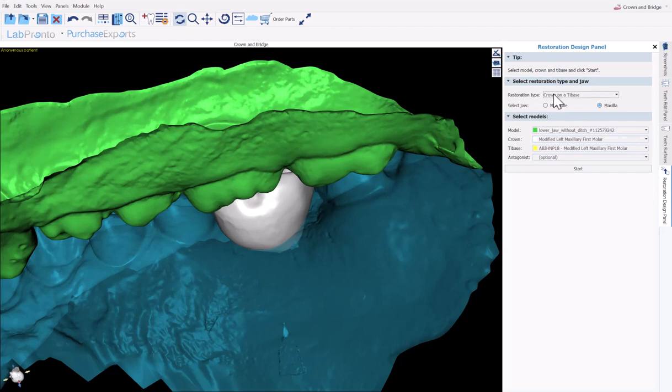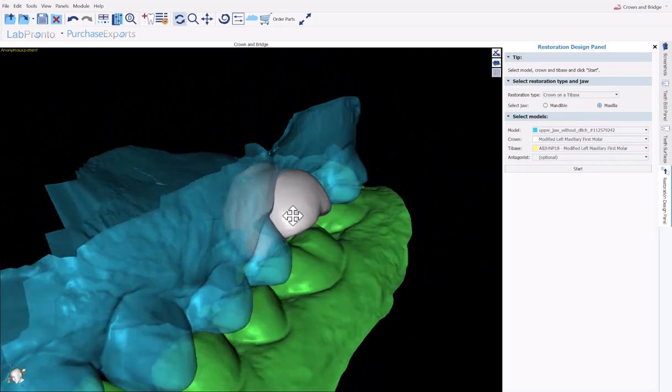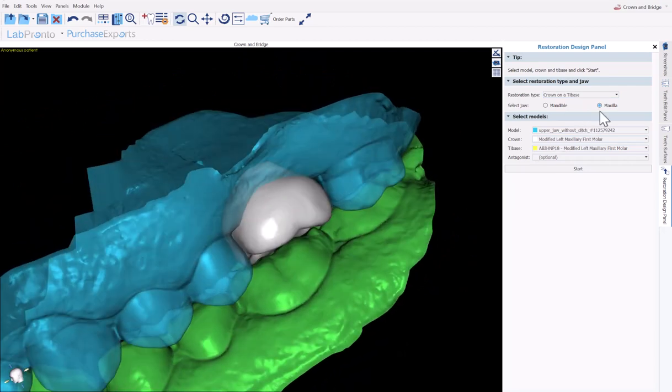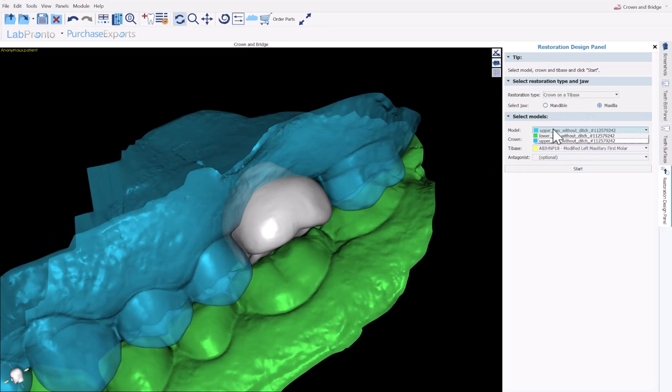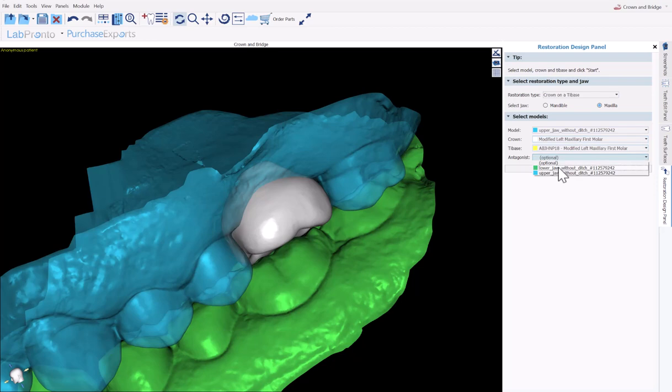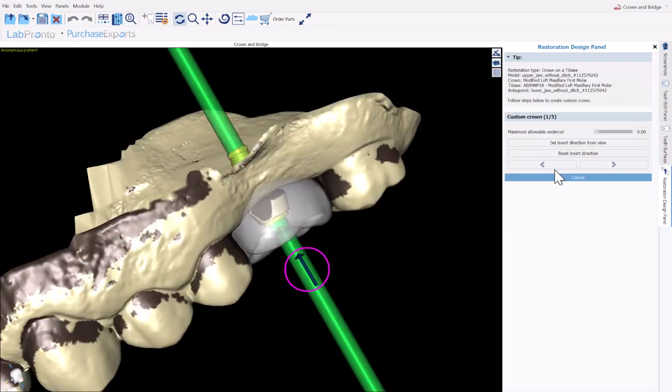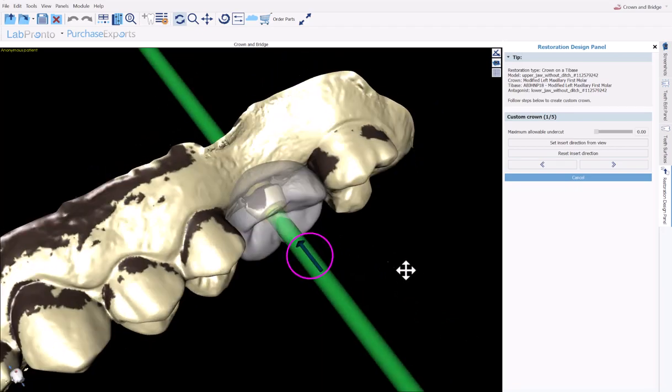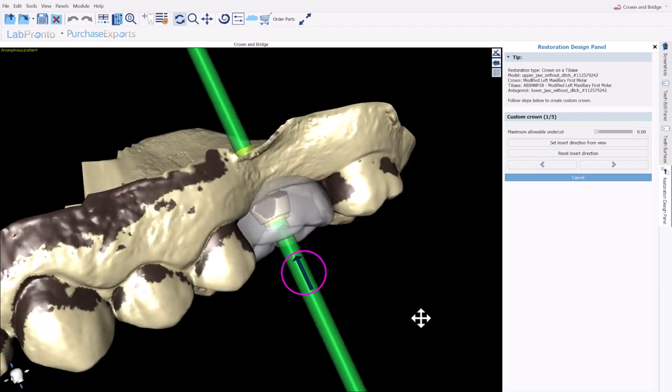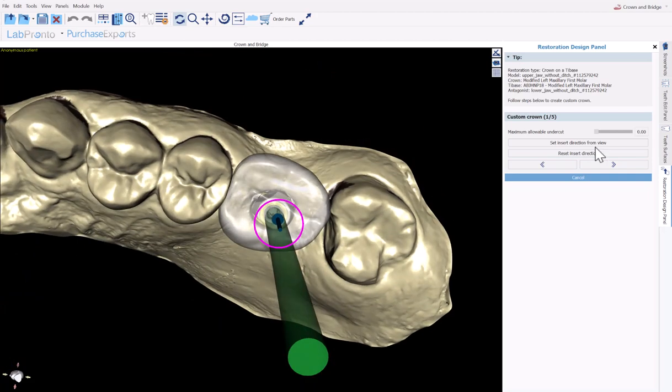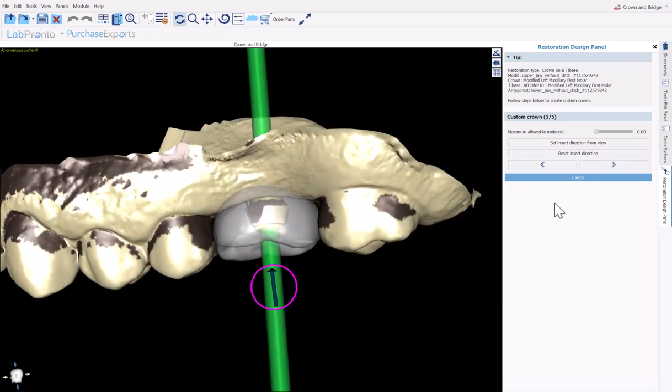The restoration type is crown on a tie-base. The relevant jaw is the maxilla. And we're going to confirm the selections here. The model we're operating on is the maxilla. The crown is the crown and the tie-base is the tie-base. We could go ahead and select the antagonist as well. I'm going to now click start. And we're just going to go very quickly through the short wizard process. We have our path of insertion, which we can modify via the arrow, or by aligning the model on screen and clicking set insertion direction from view. And then we go ahead and click on next.